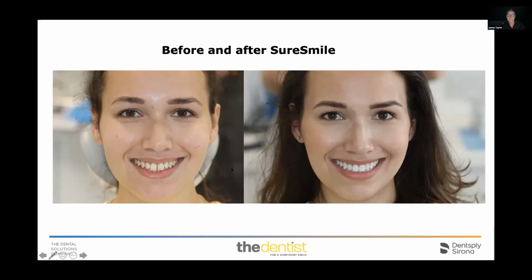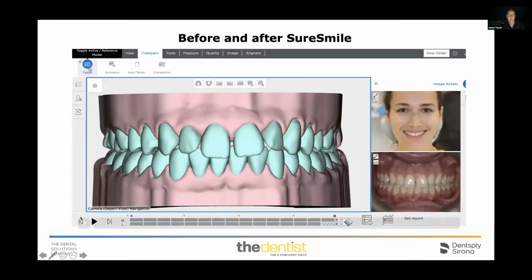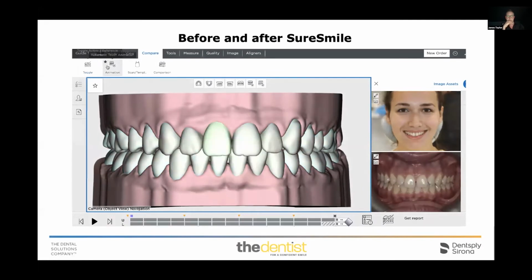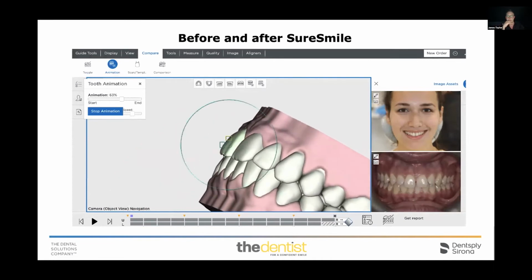She completely changed. And again, I made no changes, I don't think, from the 4 backwards. It was literally 3 to 3 change. That's all I did. Again, that's after the aligners were finished, before I removed the attachment on the upper left 2. And here you'll see the changes I made. I did move the 4, but very slightly on the right. It was just derotation and essentially 4 teeth mainly moving to give me that result. I didn't affect the bite in any way.